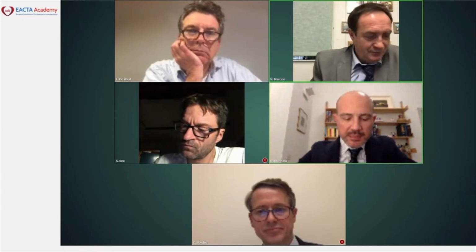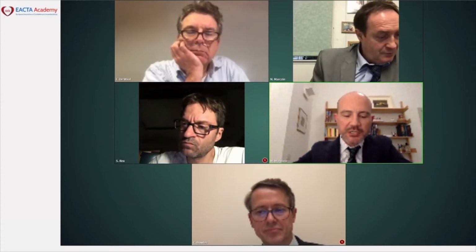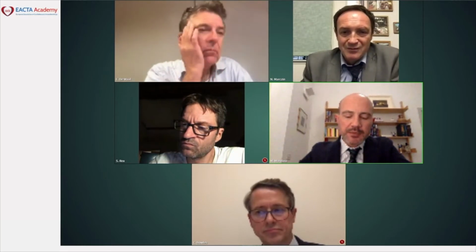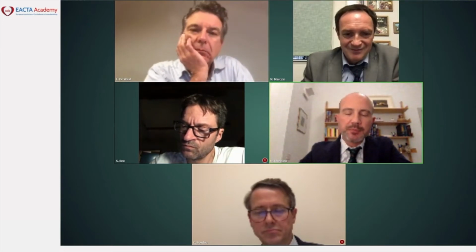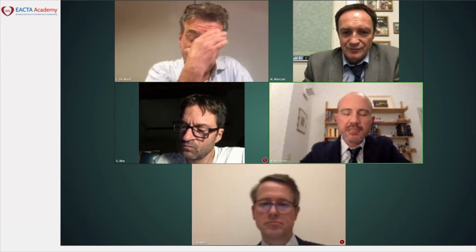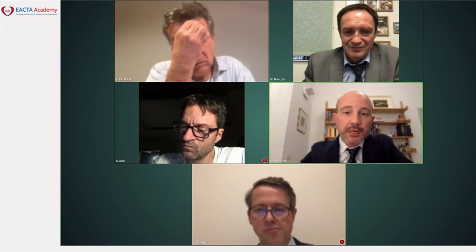Yeah. So the questions, I think, well, positioning is a bit challenging. You need to be careful positioning this patient, not only for the position of the patient itself, but also be careful not to pull the cable, the driveline, which can happen and can create problems. And it's reported that in prone position, sometimes you can have obstruction of the outflow cannula, even though rare.